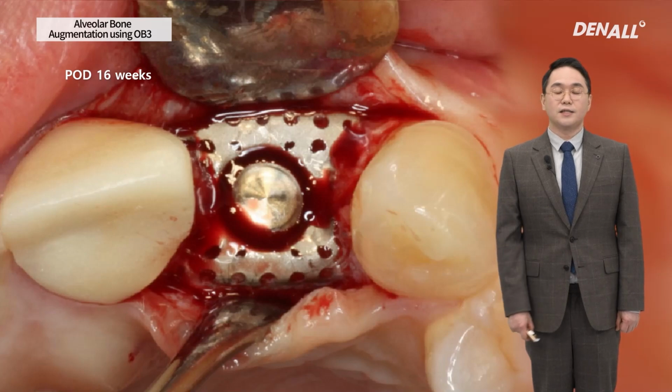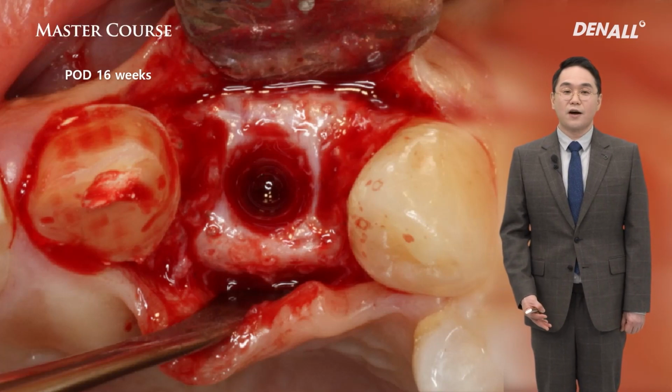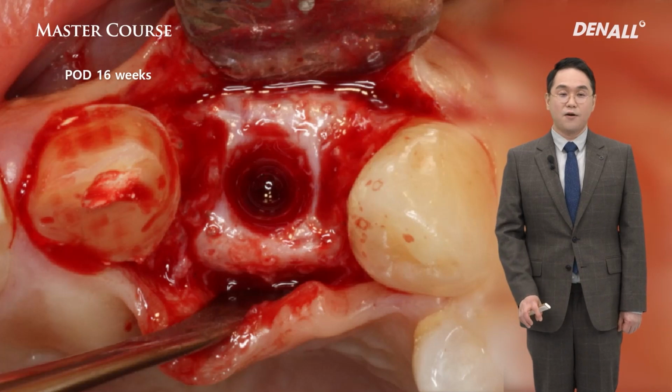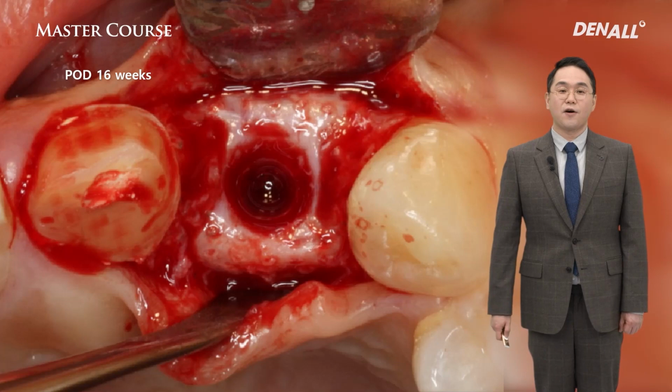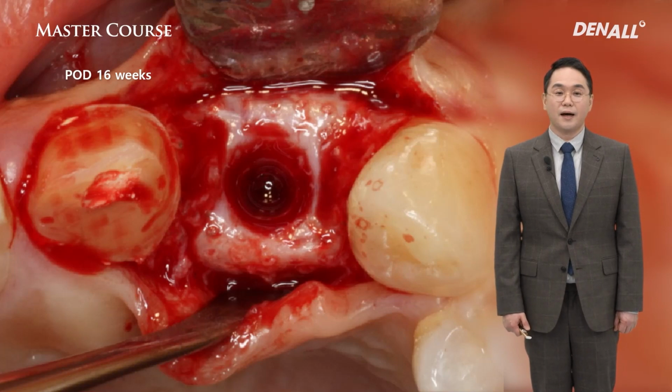Horizontal incision and the circular incision near the adjacent teeth were made. Flap is raised and Jawbuilder is removed. Removing the Jawbuilder is the same as removing Ausbuilder. Cover cap or healing cap is removed. If a flap is raised along the Jawbuilder, it can be easily removed.